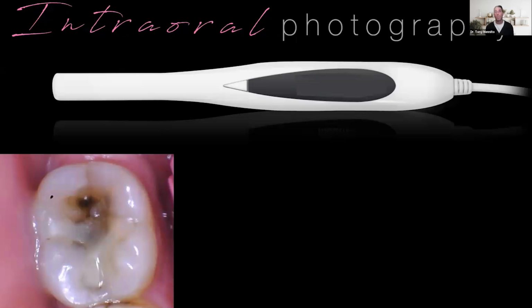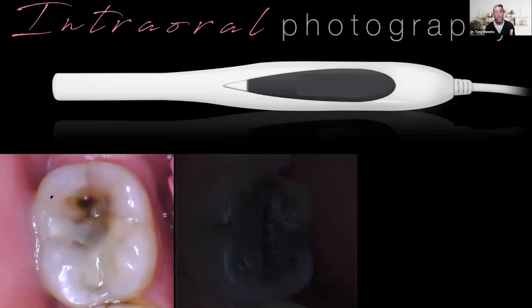And then intraoral photography, once again, one of the things that I absolutely love is sitting down with a patient to show them their own teeth. I think it's a really important part. Most patients have never seen their own teeth, and sometimes they're grossed out by this. I don't really care, right? If you have an issue on a tooth, I'm going to show it to you. Because remember, every new patient is brand new to us. They don't know us. For me, it's about building trust. So when I tell a patient like this, hey, you've got a cracked tooth, you've broken out a filling, you need an onlay, right? I can show them exactly what I'm talking about on that photo.